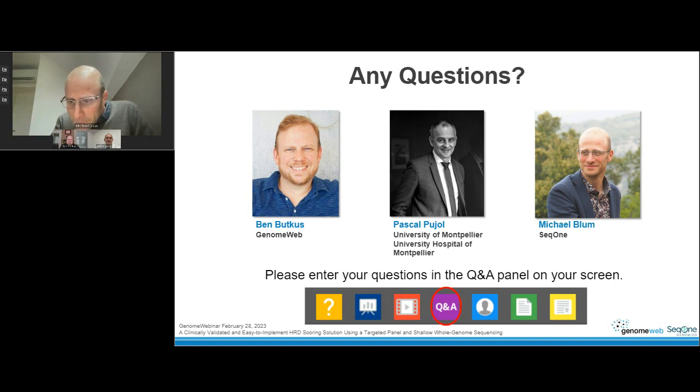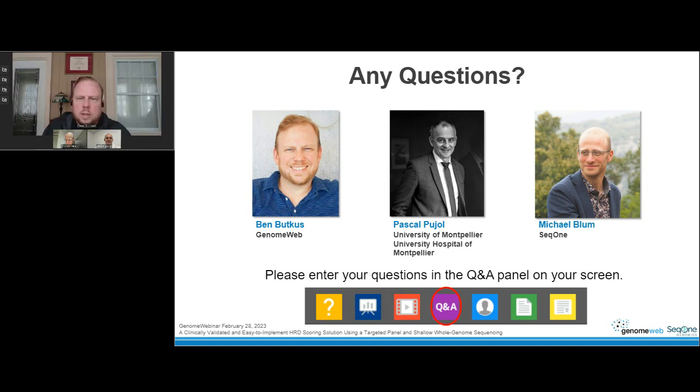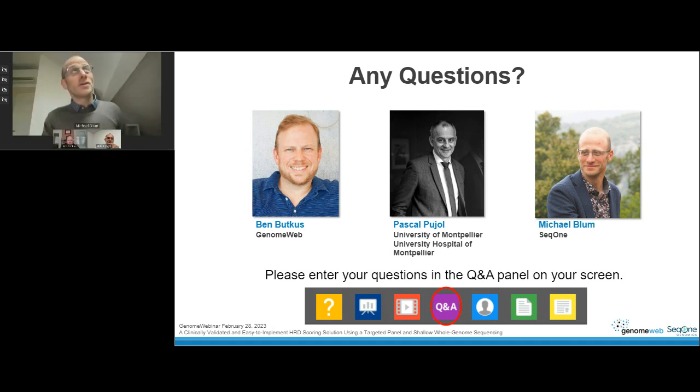Thank you. Our next question: Did your validation occur on actual samples from the PAOLA-1 trial? Yeah, that's correct. The validation comes from 368 samples from the PAOLA-1 trial.